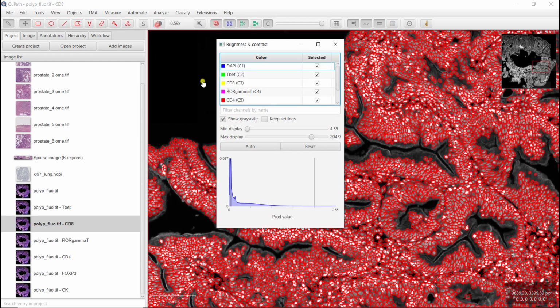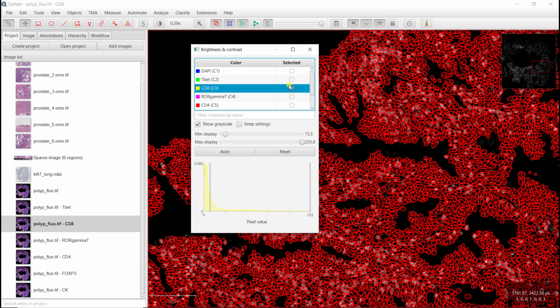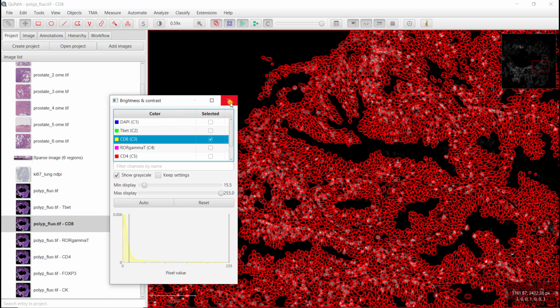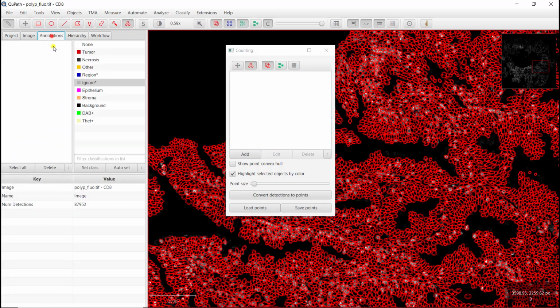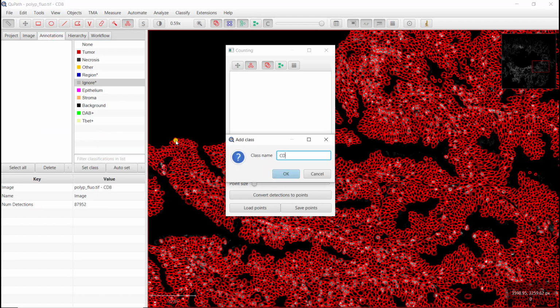So here I want to look at CD8. So I'm going to look at CD8 here, and so then same thing, you know. So you add a new class, add class CD8.